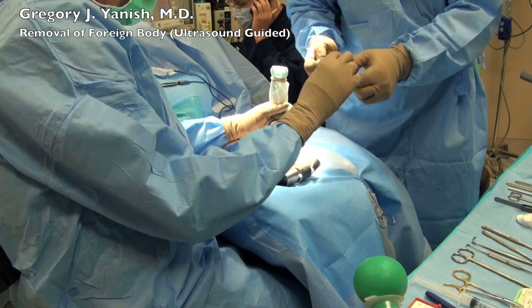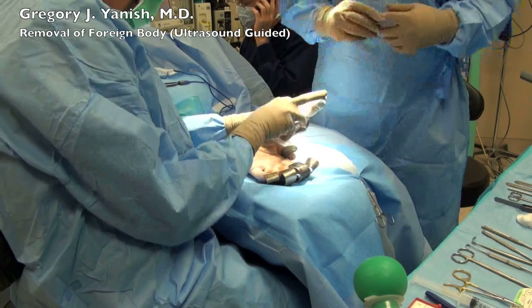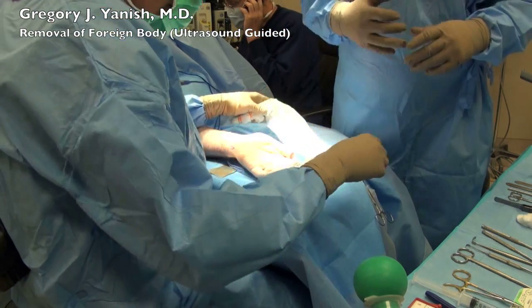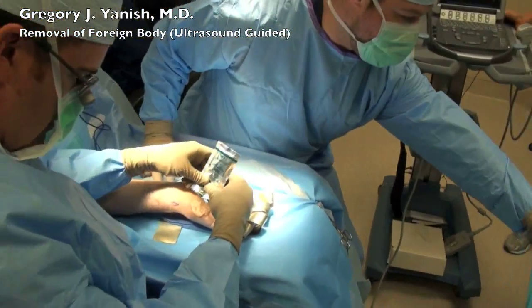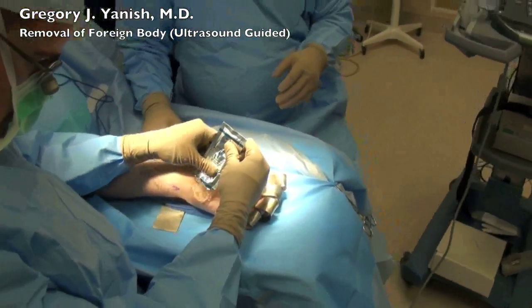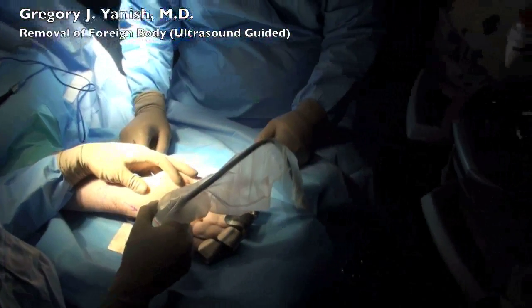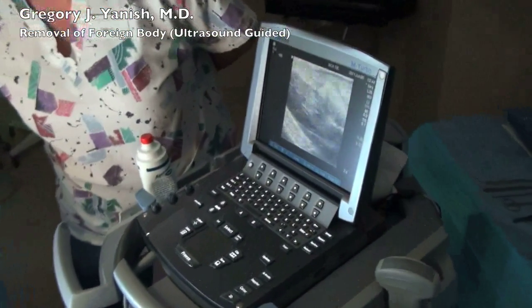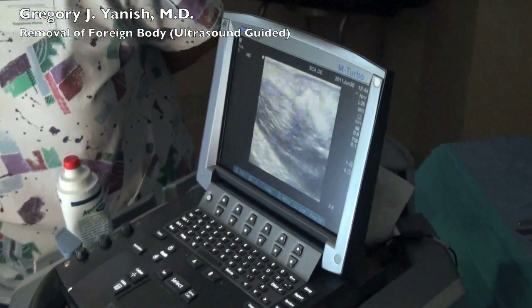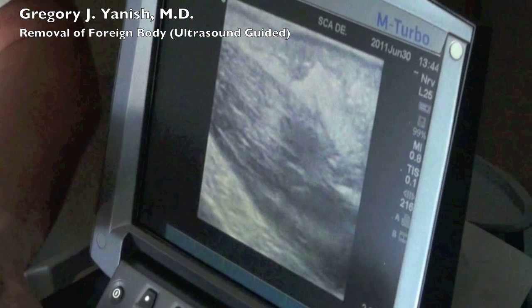In the operating room, we used ultrasound to locate the foreign body. This enables us to make an incision directly over the piece of ceramic plate, staying clear of some of the other important structures of the hand, including the nerves and arteries. You'll see me placing some sterile ultrasound jelly on the patient's hand, and using ultrasound, we're able to pinpoint the exact position of this ceramic piece. You'll notice up in the top right-hand corner of the screen is a rectangular structure. This represents the ceramic plate.